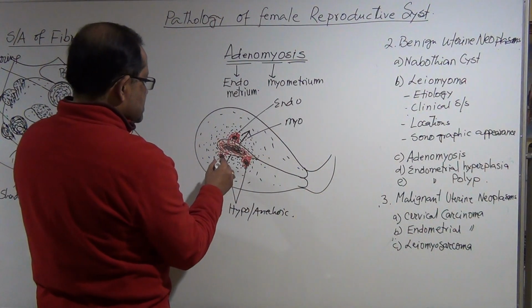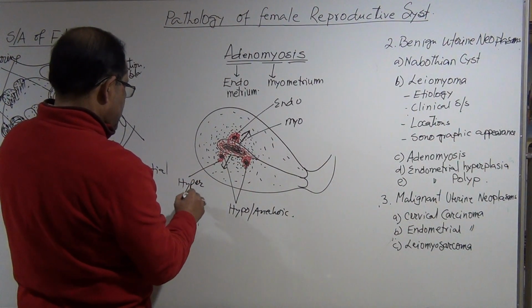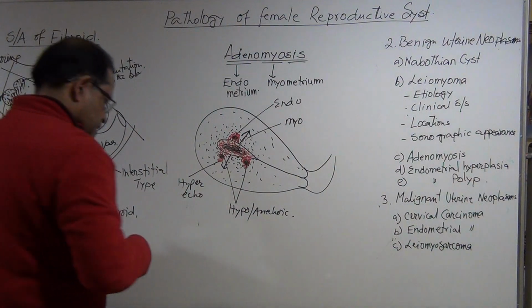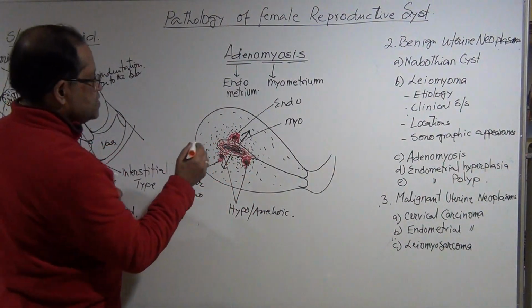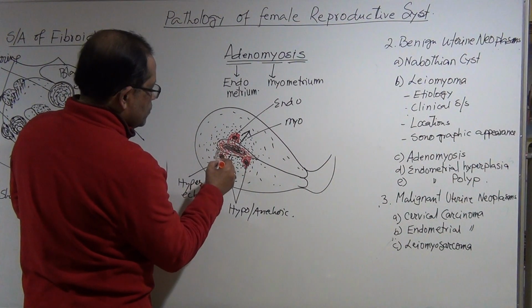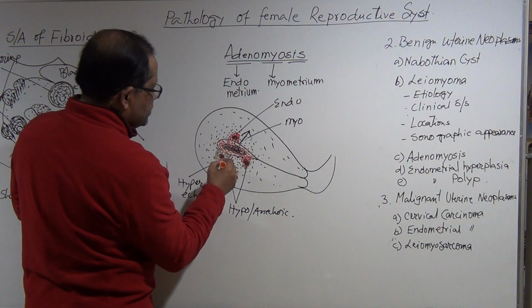Okay, so this is hyper because of the endometrium. Let me draw it a little fancy. So this is endometrium.